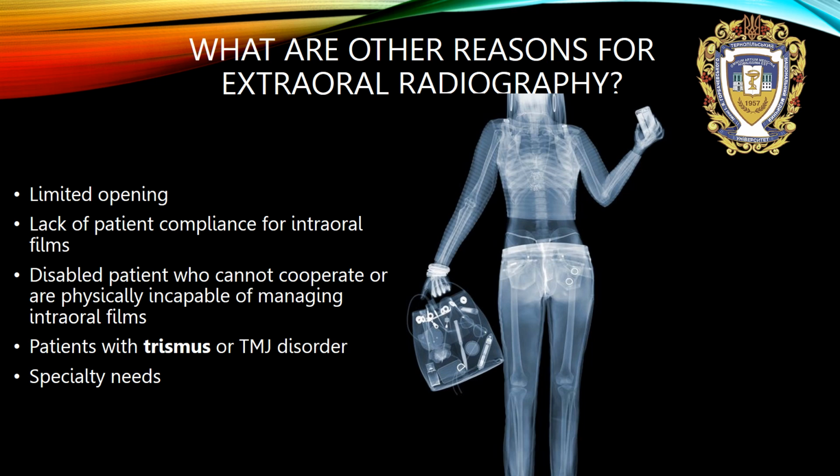But what are other reasons for extraoral radiography? Limited mouth opening. When it is impossible to put film or sensor inside of the oral cavity, we can use extraoral X-ray.